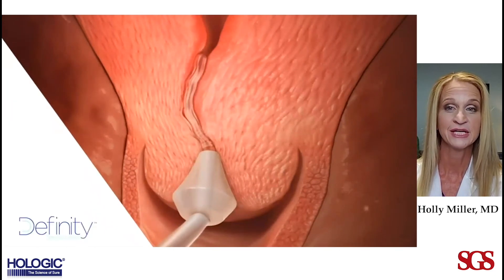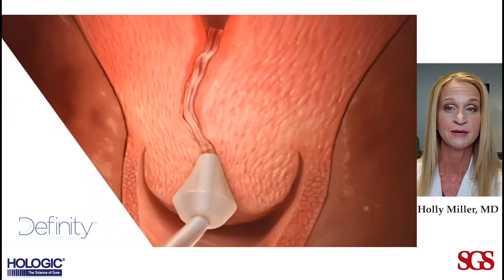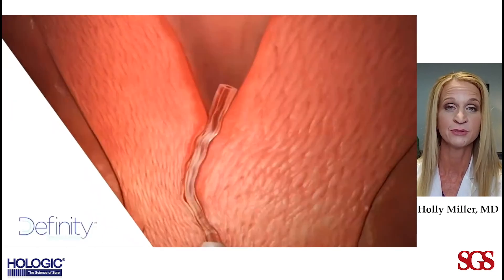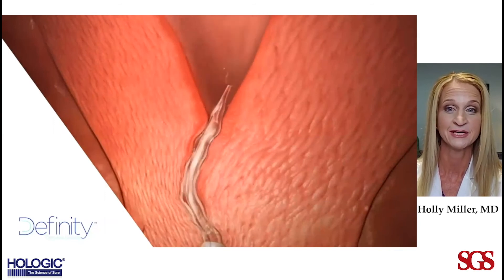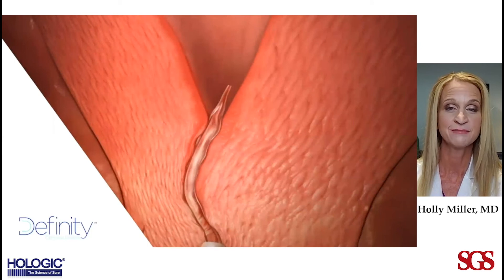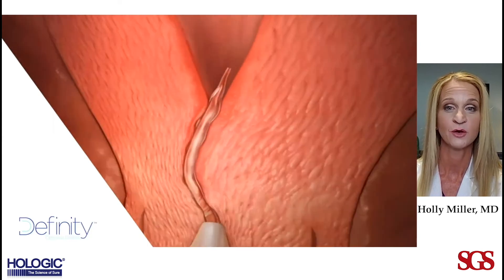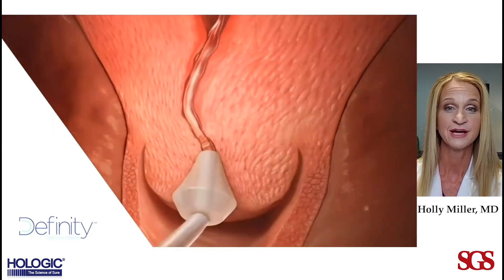The membrane carries a separate dilator balloon into the cervix while it is advancing. As pressure is increased in the membrane, it opens, revealing the dilator balloon.